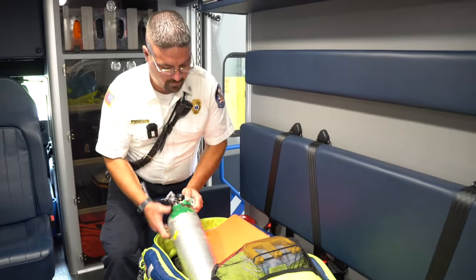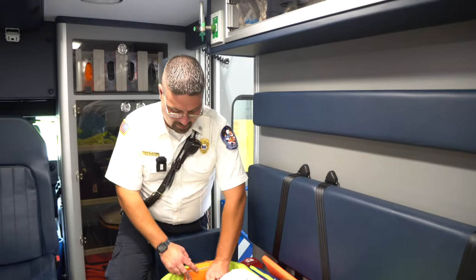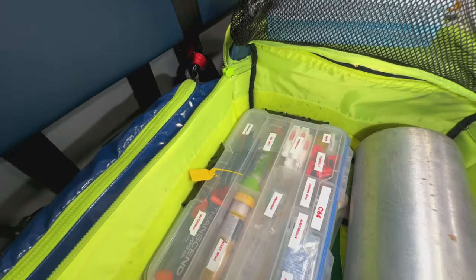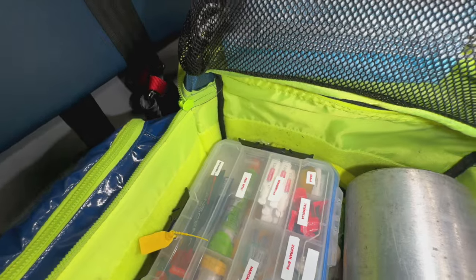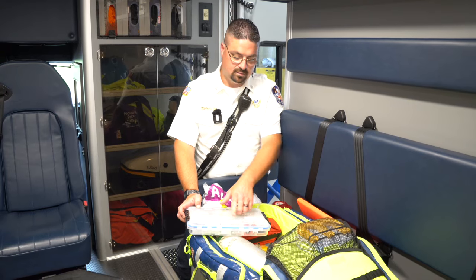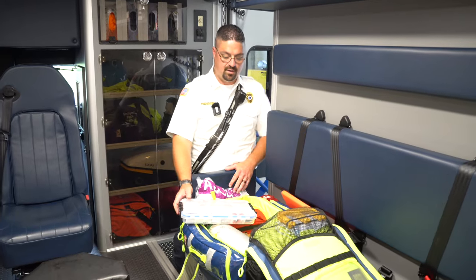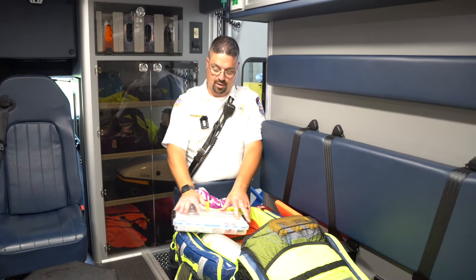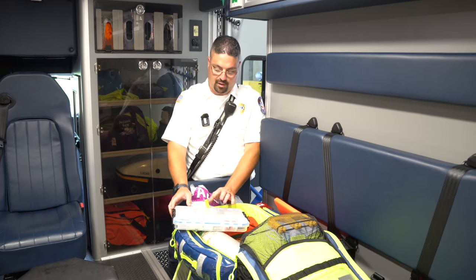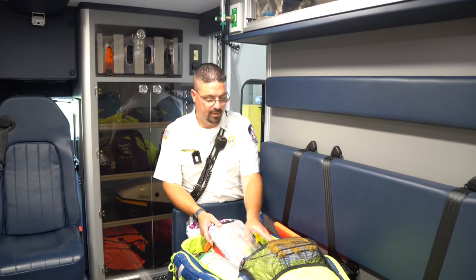We have a large oxygen tank and a clipboard for paperwork. Along with the oxygen we have our medications: aspirin for chest pain and ACS, Tylenol, Zofran, Albuterol for breathing treatments, Duonebs — Albuterol combined with Atrovent — Benadryl, Narcan, pediatric and adult EpiPens for allergic reactions, and oral glucose tubes for if someone's blood sugar is too low.